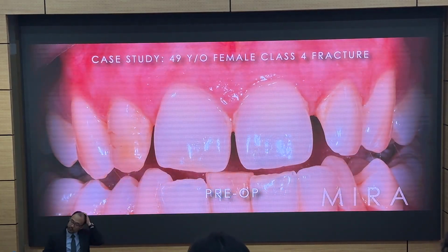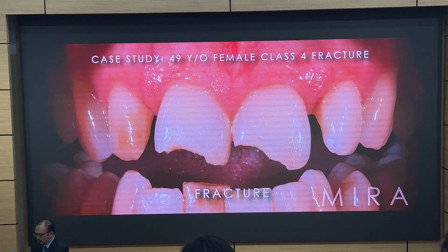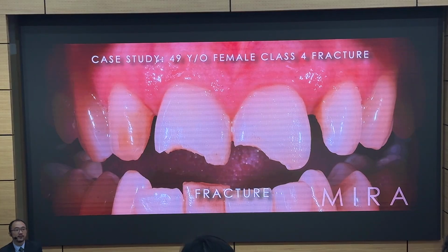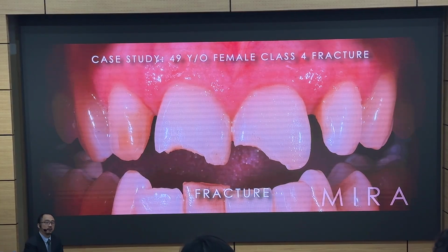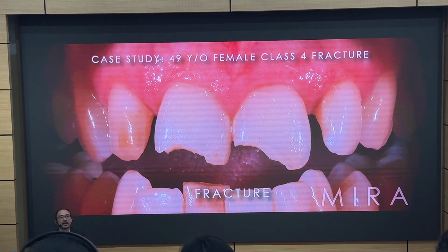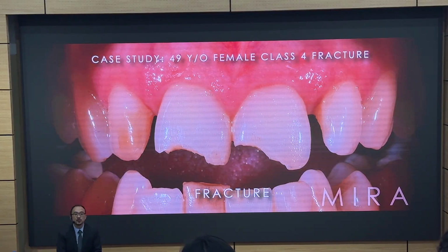In some cases, unfortunately, wax up is going to be the only way possible. This is Myra. Myra fractured her teeth. She came in around 20 minutes after the fracture happened. She was in a lot of pain. I couldn't do anything for her. I couldn't even take an impression. So this is where, thankfully, digital dentistry is helpful.